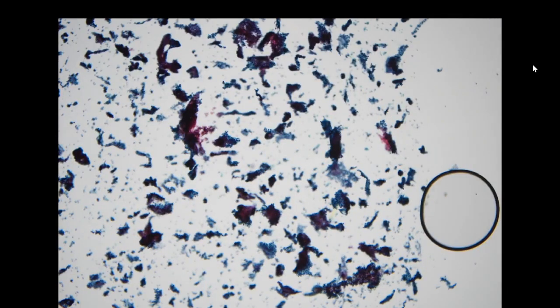The next specimen is coming from an 83-year-old female. So it's an old lady, and she had an enlarged lymph node in the left subclavicular area. So this is the aspiration of the left subclavicular lymph node. On low power, we already see hypercellularity, a lot of cells.